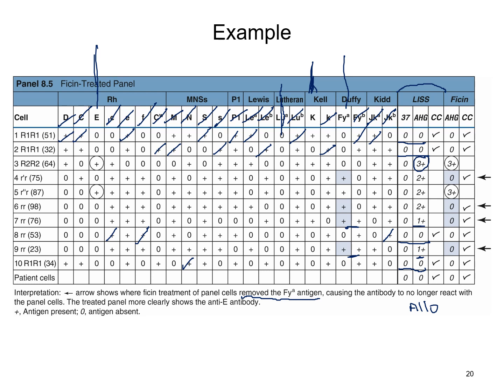You know, there's really no need to do any kind of additional testing, because if you use where the textbook said 2 positive reactions, you've actually got those here and here. Oh, excuse me. You got those 2 positive reactions there, and you can see where this E is heterozygous, so it's a little bit weaker there. And then you got the Duffy that's reacting.